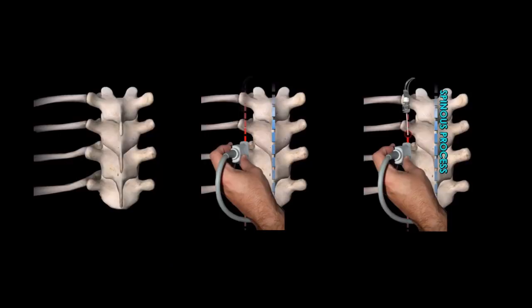After selecting the target transverse process for the block, place the transducer in a paramedian sagittal orientation, approximately 2 cm away from the midline, the spinous processes, and try to visualize the transverse process.